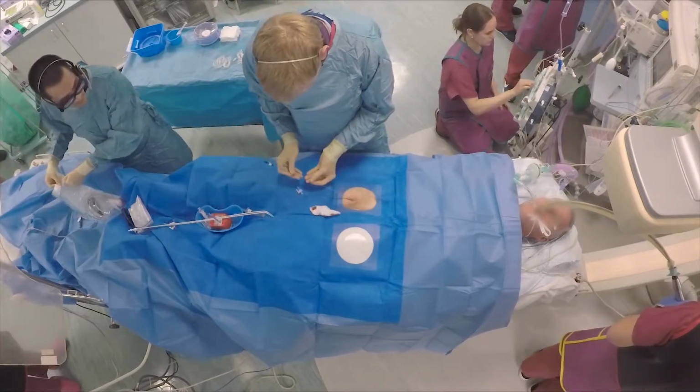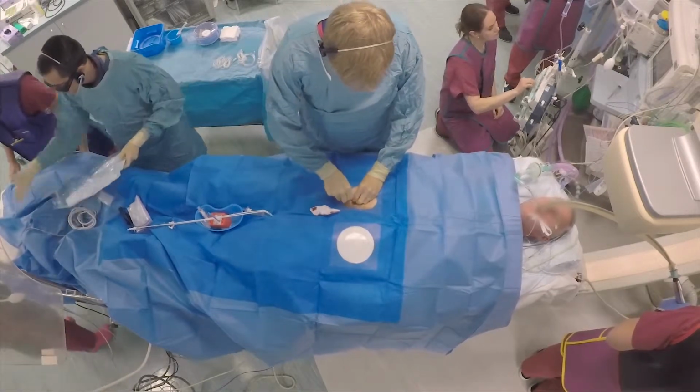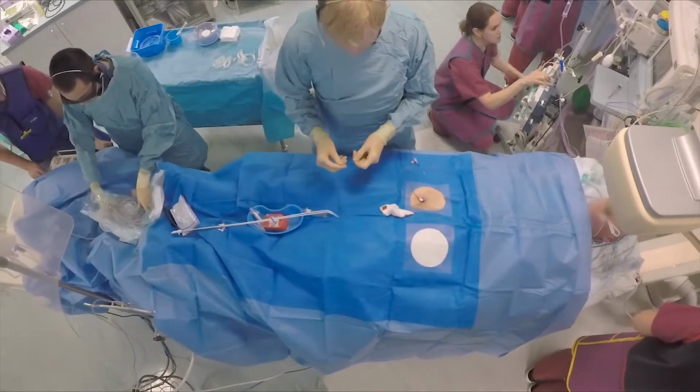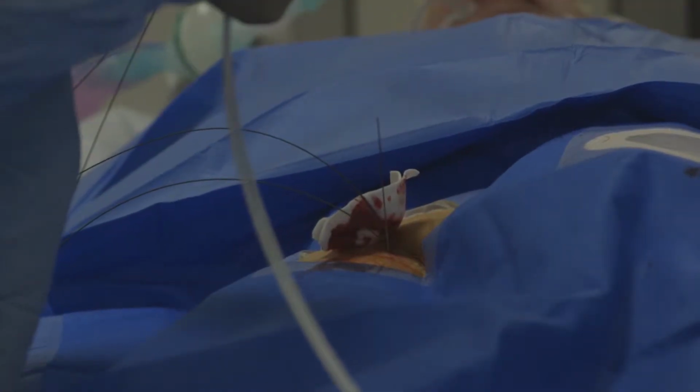Okay, can I have the table up, please? Straight away, we go with the short sheath for the coronary sinus catheter and two long sheaths, which you can see here, for both the ablation catheter and the mapping catheter.